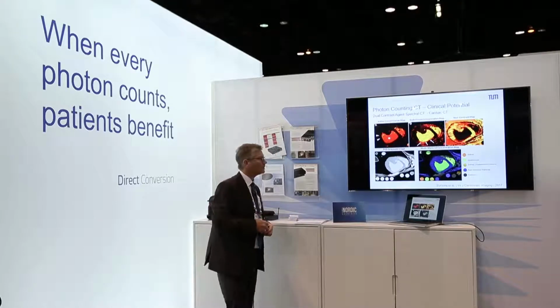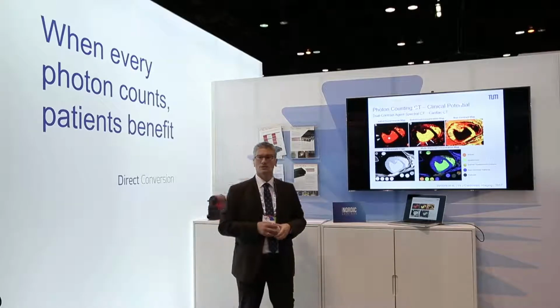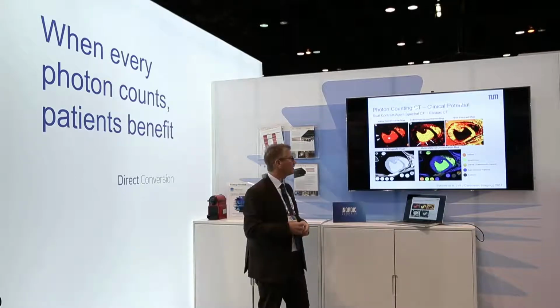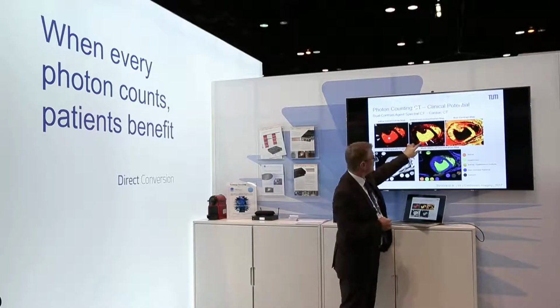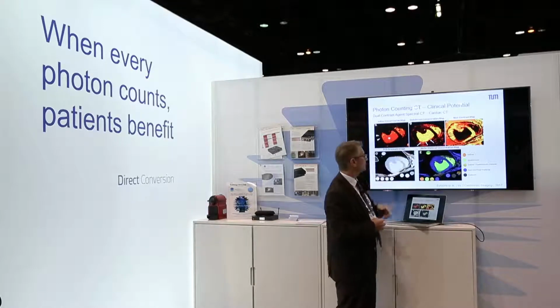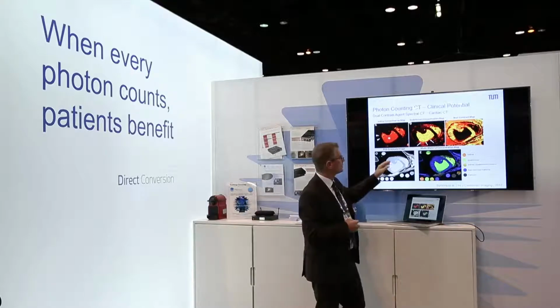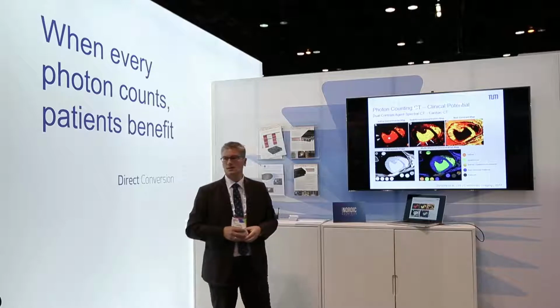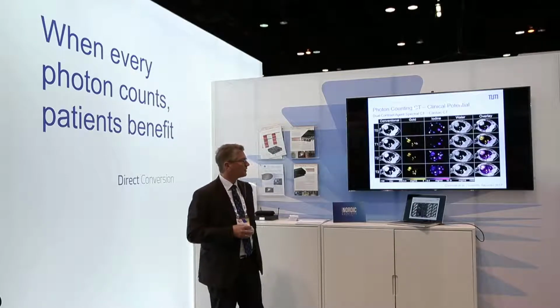Here's another example, that's about cardiac CT. In cardiac CT, you are using these phases to look at signs of infarct. If you actually have a late uptake in a later stage phase, like shown here, then you can actually be sure that there's a problem. Here iodine and gadolinium have been used, and then again the procedure I just explained to you, the multi-phase protocol. So these phases are something that I use quite often.